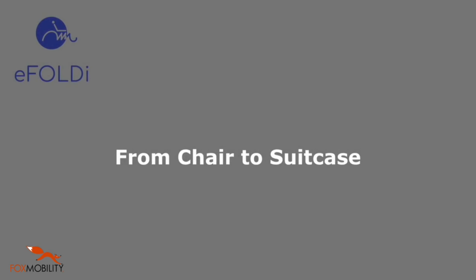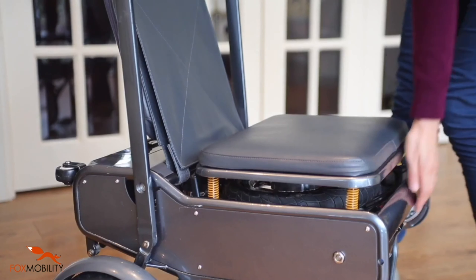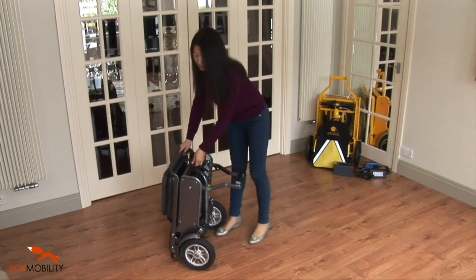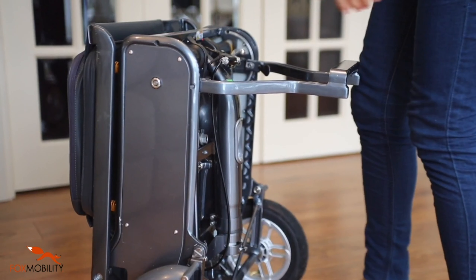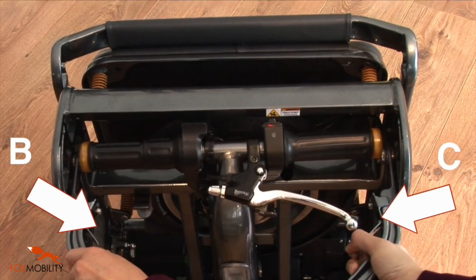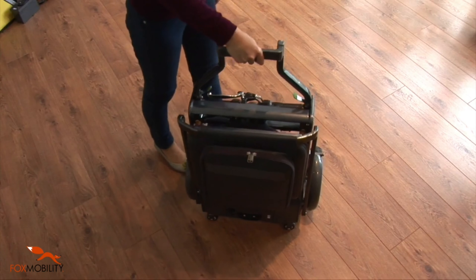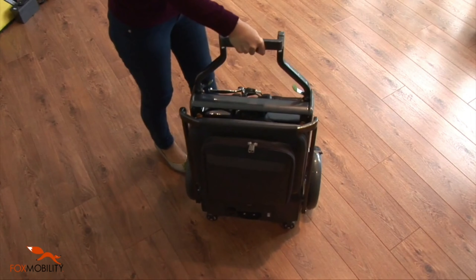Folding the eFoldie from a chair to a suitcase. Fold the seat's backrest forward and down. Lift it until the eFoldie is standing on the rear wheels and the lateral casters. Press latch B and C with your thumbs. Lift the front stand into its upright position. Now the eFoldie is fully folded into a suitcase and can be rolled sideways on the lateral casters.